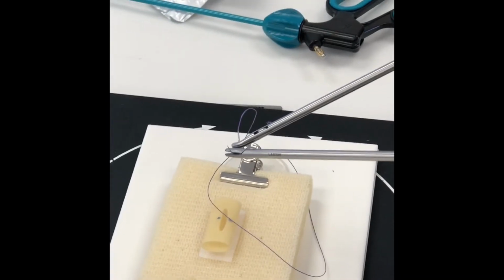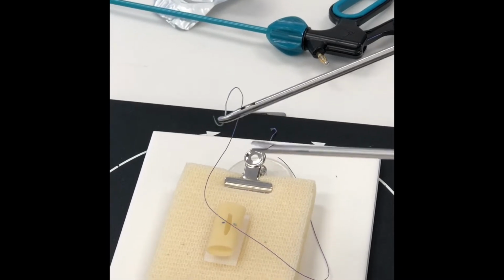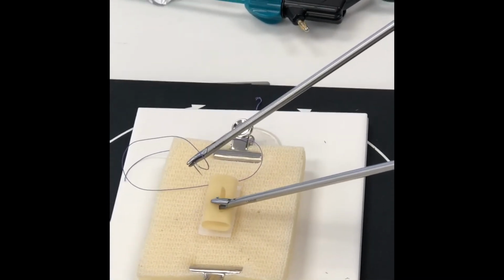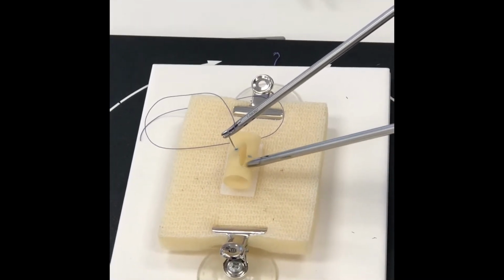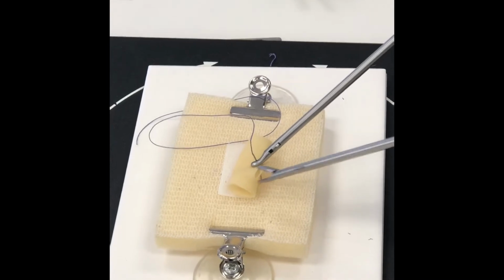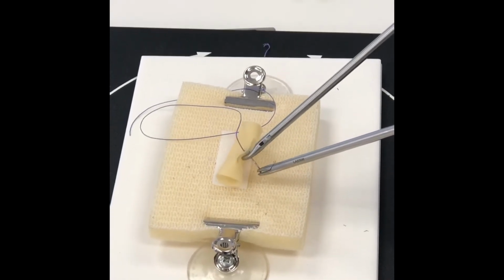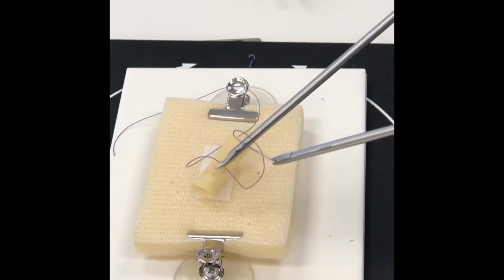To drive the needle, it's a curved needle driver, you want it to be like it would be outside of the body with the tip going to the left. Okay? Then next, I'm going to drive my, these are far away. Make my little knot. Usually with a grasper, not a needle driver. So I grab with my non-dominant hand so that I can maintain the angle, so I never have to reload more than one time. And I do this little pulley thing, whatever you want to do.